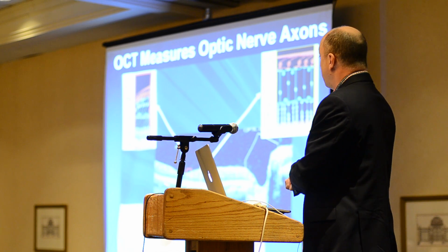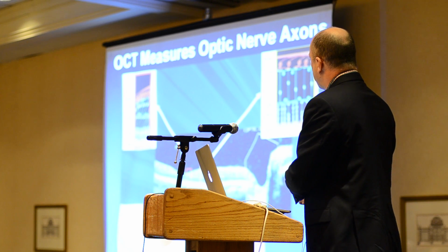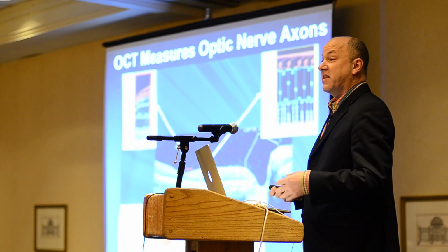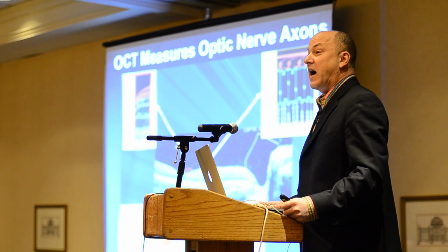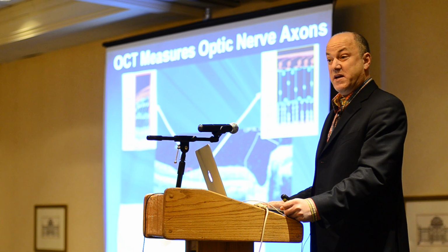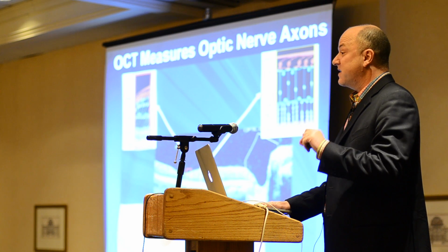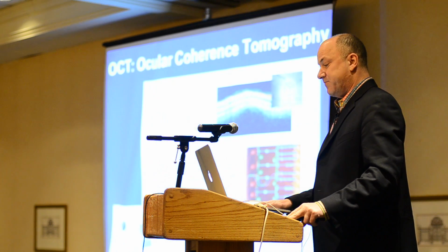And also, we can point this OCT machine away from around the optic nerve, this area here, and onto the retina, and be able to get, as you can see, very sharp images that can tell us about other retinal problems. So that's why we're looking in the eye to tell you something about what's going on in your brain in this disease, because the injury to the optic nerve is something we can measure in a very sensitive way, the axonal compartment, by looking inside the eye at the very origins of the optic nerve.